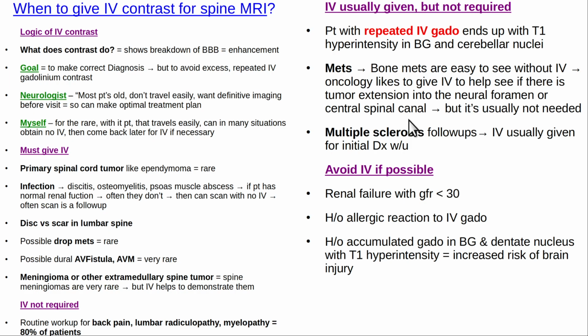So some of these patients, the indication will be listed as rule out cord compression, and you're going to be scanning the cervical spine, the thoracic spine, and the lumbar spine. And these patients who are in a lot of pain, they might only give you 40 minutes of table time, and you want to get all your pictures as fast as you can, because that patient is going to start moving and squirming around, and then the pictures are going to be of very poor quality when the patient's moving on the table, and the patient will even just say, look, I'm in too much pain, I cannot continue with this scan.